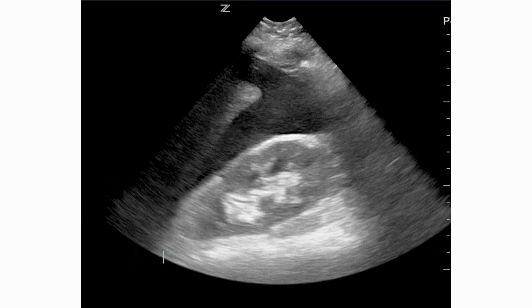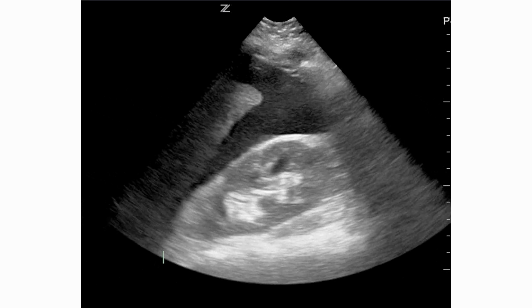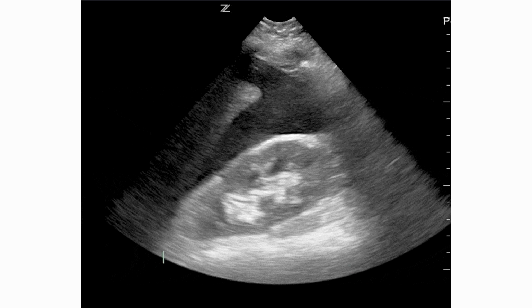So let's go through a few examples of what we might see in a patient while we're doing the FAST. As we look at these, I want you to try thinking in your head, okay, what view is that? Is it normal or abnormal? And what are we seeing?